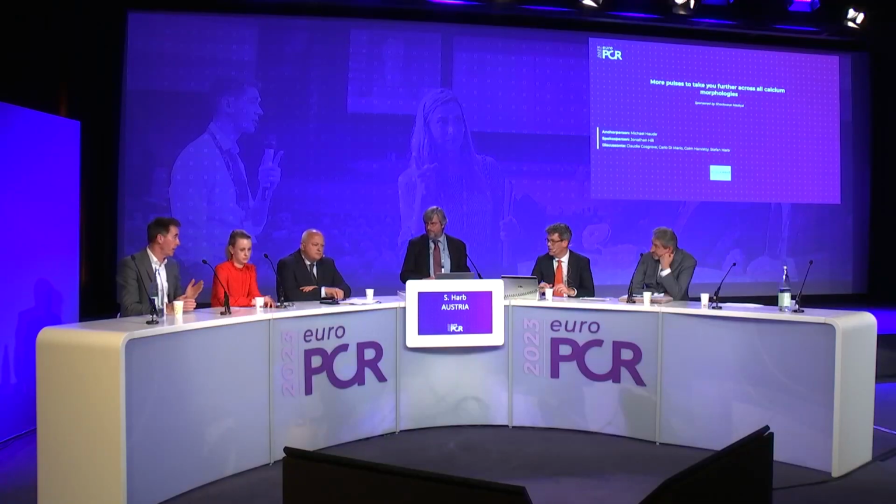Yeah. That these eruptive nodules erupt again. And this is why I'm raising the point, because maybe it's not about hitting at the nodule, but hitting at the sheets to make the vessel more compliant, to have less force on this volcano. Stent fracture mechanics, that these are causing because of torsion within the vessel, especially if you think of a right coronary artery which moves 3 centimeters with each cardiac cycle, and then you put in the stent, and the stent's fixed here and moving in between.